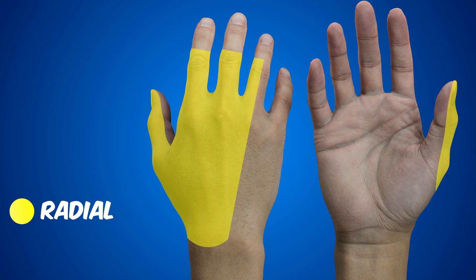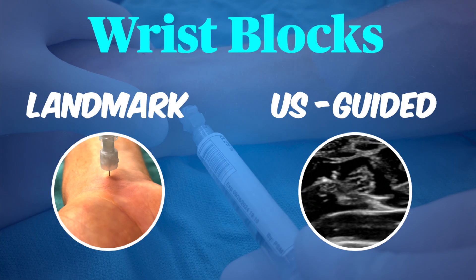It covers the back of the lateral hand, including the dorsal surface of the thumb. We'll discuss two safe and effective methods to block these nerves at the wrist: the traditional landmark technique and the ultrasound guided technique. We'll talk about the ultrasound guided technique first as it helps us to understand the anatomy.